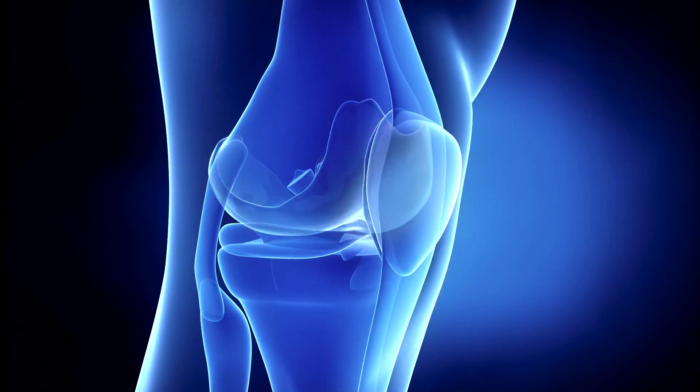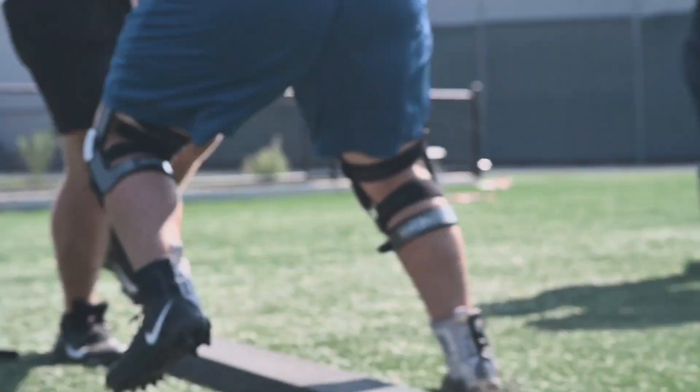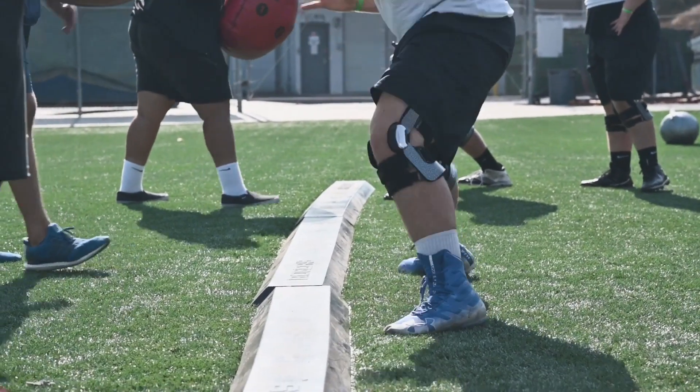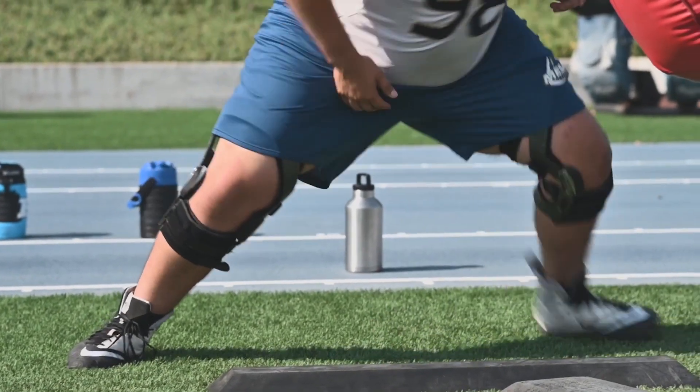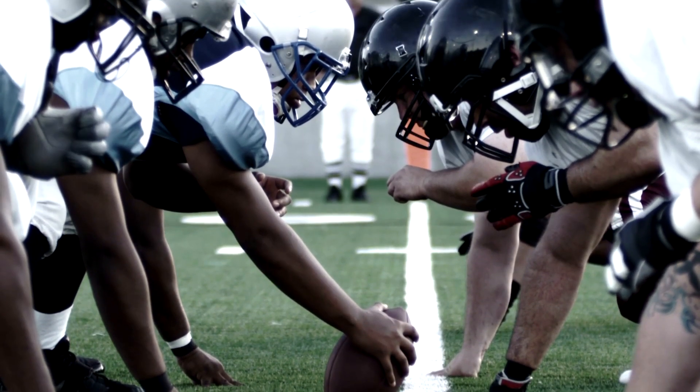Seven, eight years ago, we were seeing quite a bit of knee injuries, specifically MCLs and ACLs. They see the value of that keeping their athletes safe and healthy and on the field and in competition, and to get these kids not only safely playing on the field here for us at Mesa, but on to their future goals, whether it's at the next school or the next level that they want to get to in their sports careers.